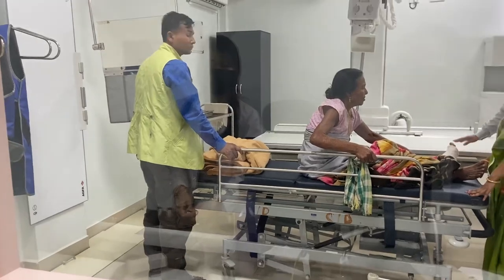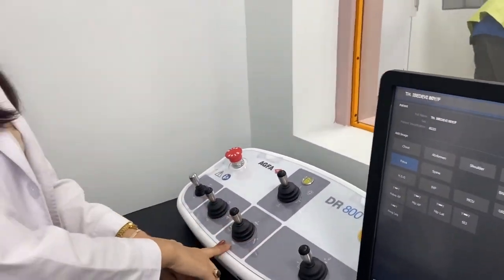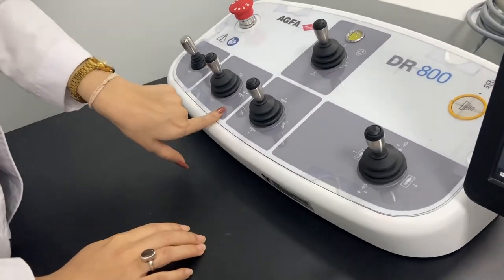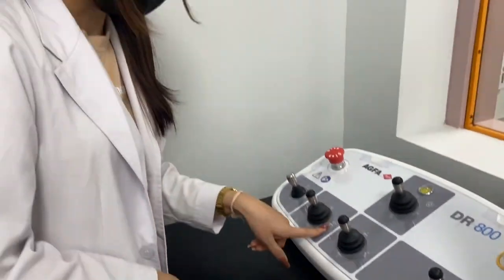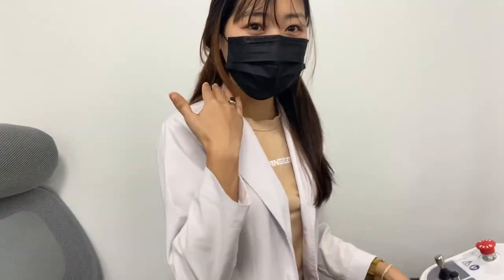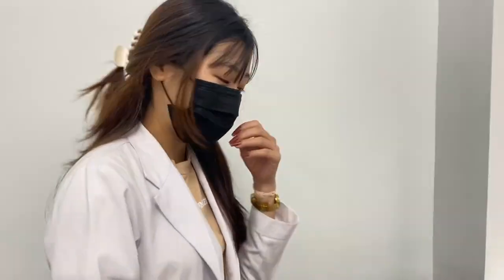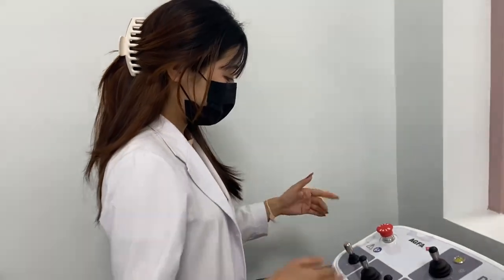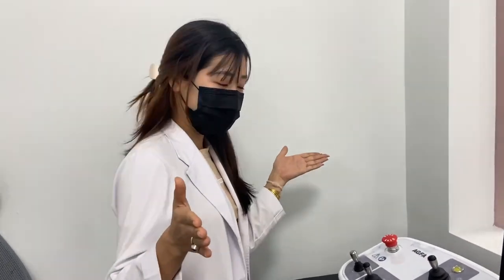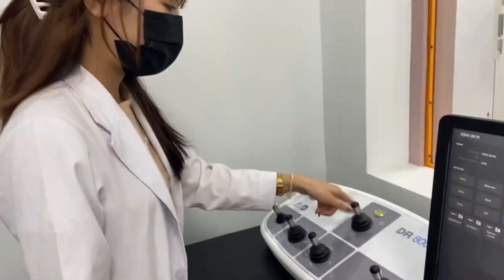These things we are using for this row. This is the third row, and then this is for both the collimator and the table. So if you want to take a full shot — like from cervical to the pelvic — we can use this one. This is for both. The last one is for the collimator, so we can draw that one, and this is also for the table only.